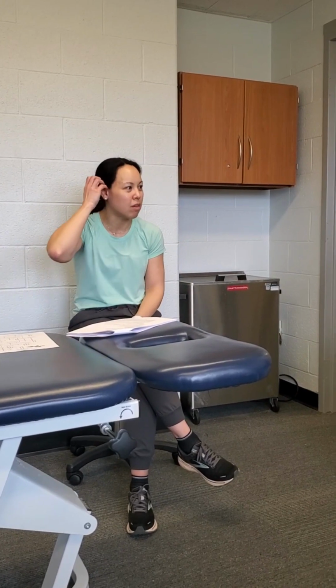Kind of, you could do one or the other. I personally will probably do the uninvolved side, especially if we want to train the uninvolved side as well. Or maybe with an elderly frail patient, let's see how you feel and then rate yourself on the scale, and that might give you some more information. But typically I'll probably use the uninvolved side.